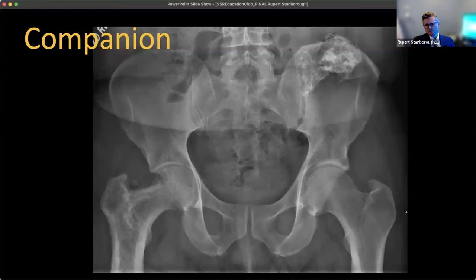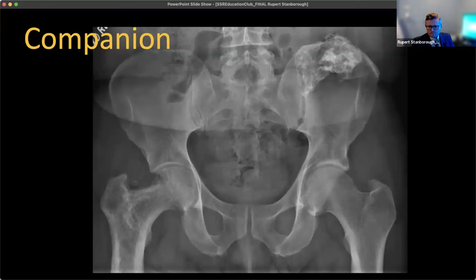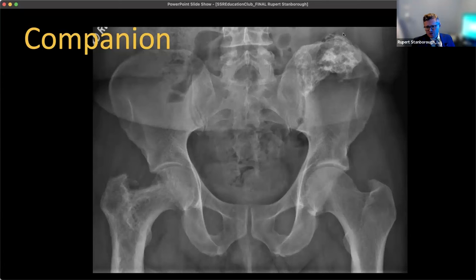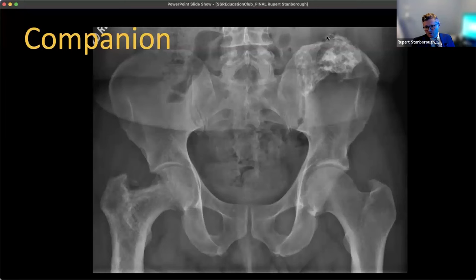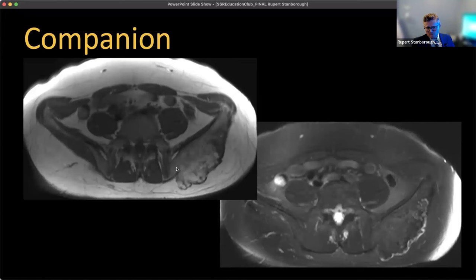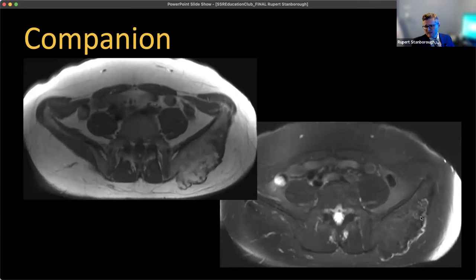Here are some companion cases. Looking at the left iliac bone again, we have a bone finding projecting over the bone with some component into the soft tissues. On MRI — axial T1 on the left, axial T2 fat sat on the right — you would describe this the same way as an osteochondroma, because it is one. We're continuous with the marrow space and the cortex. When you look at the cartilage cap on T2-weighted imaging, it's very thin, less than two centimeters. This is a benign osteochondroma.